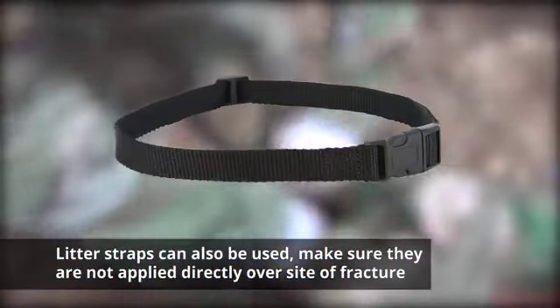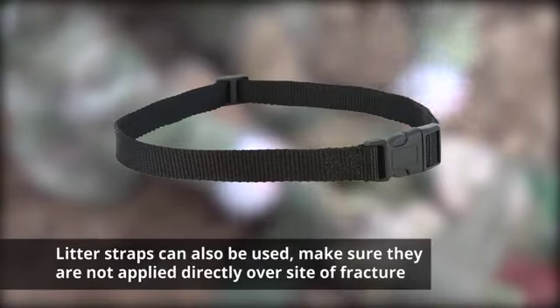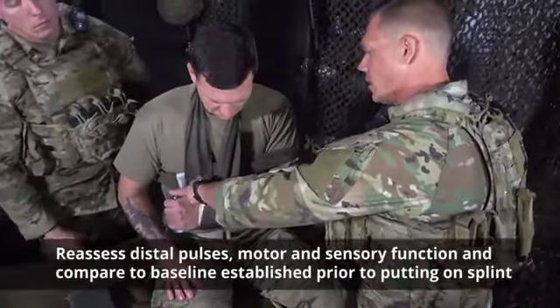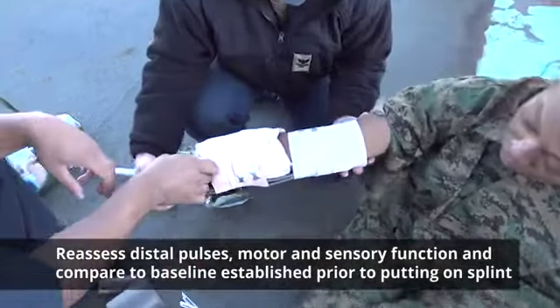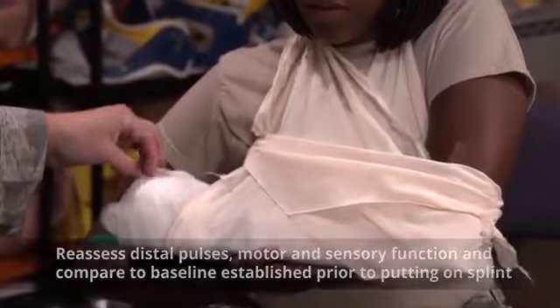Litter straps can also perform this function, but make sure that they are not applied directly over the site of the fracture. Once the splint is applied, reassess the distal pulses, motor and sensory function, and compare it to the baseline you established prior to putting on the splint.